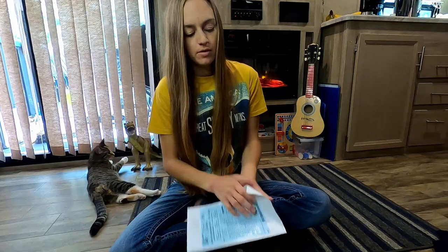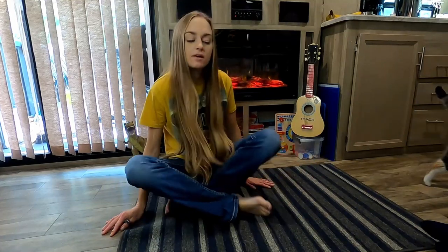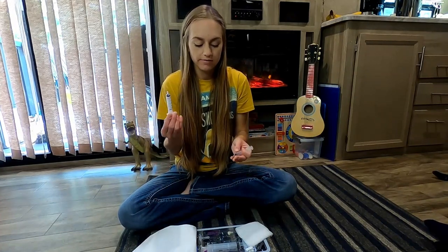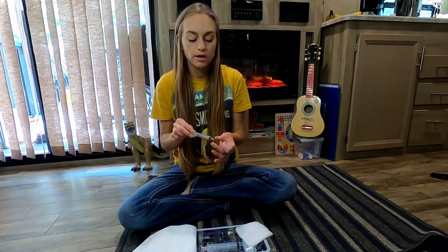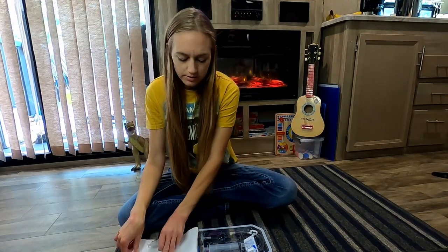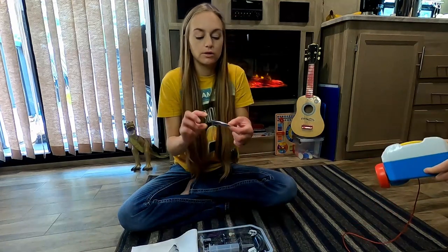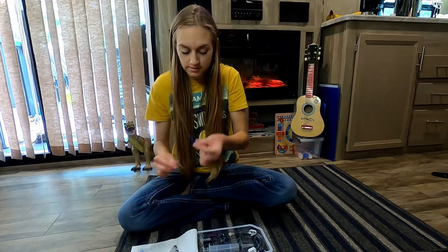Open it up. We use this little syringe. I like to also have a spare from a previous one on hand, because we will pull the water out of the balloon first so that we can take it out, and then we will put the clean water in the new button once we get that one in. I don't really know what that little gauze pad is for, but I just use it as a towel. And we'll use this little lubricating jelly.